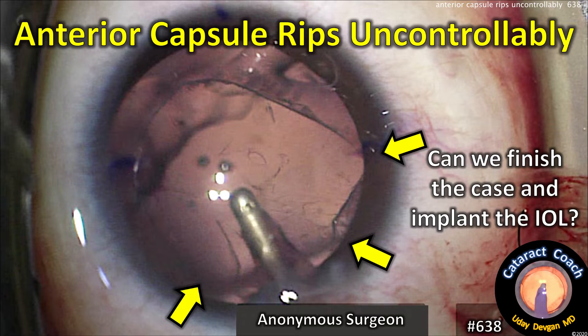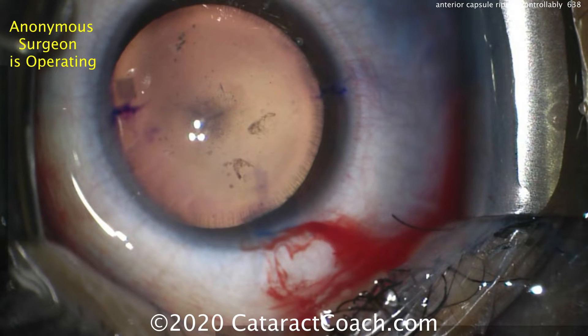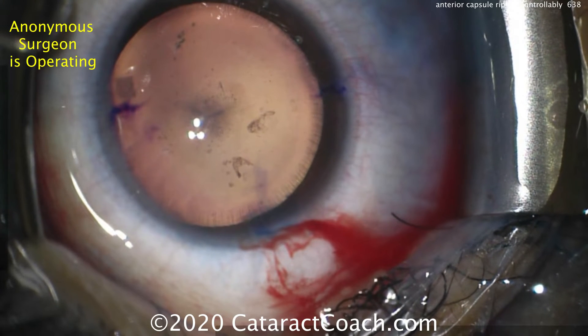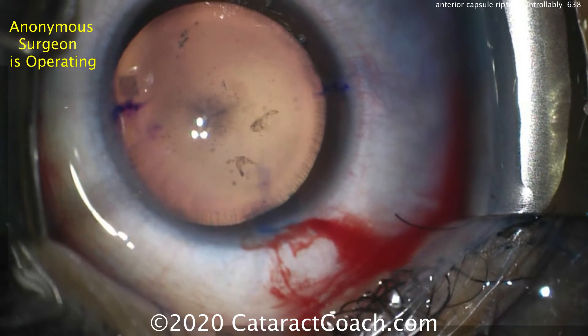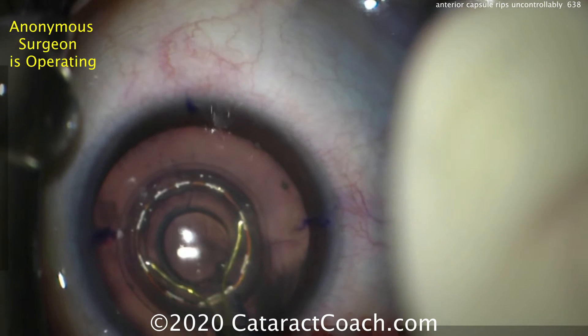CataractCoach.com. The anterior capsule rips uncontrollably. Can we finish the case and implant the IOL? Watch carefully — it's a very young patient with a cataract. Beautiful dilation, everything looks fine. Now the surgeon is an anonymous surgeon who's going to use a special device to help create a capsulotomy.